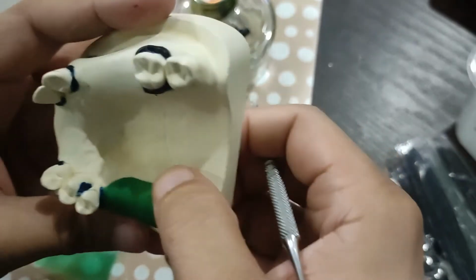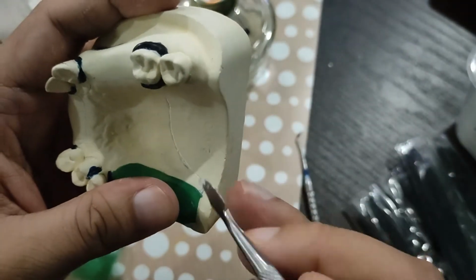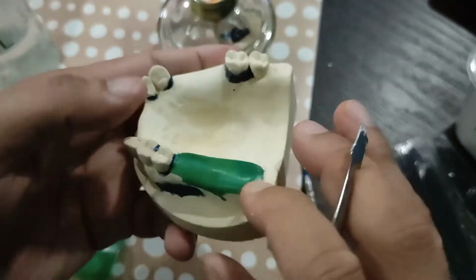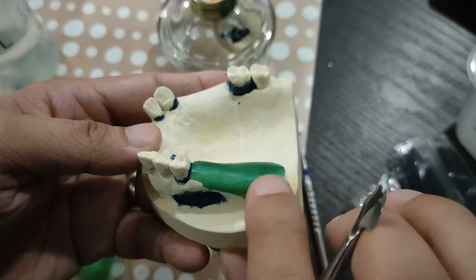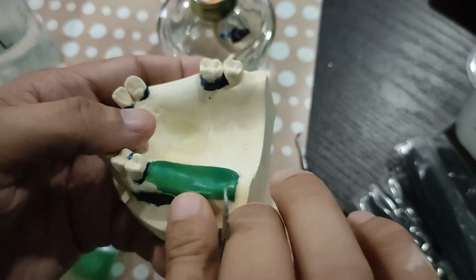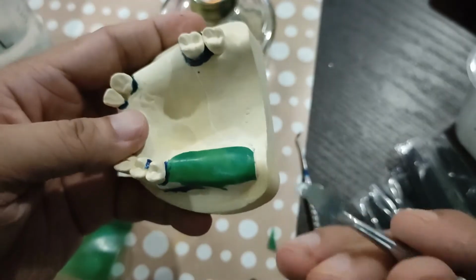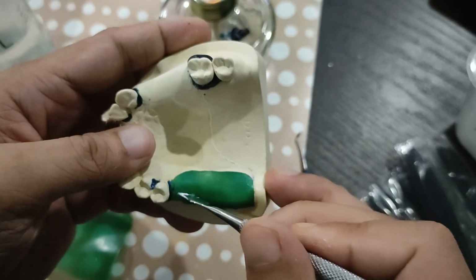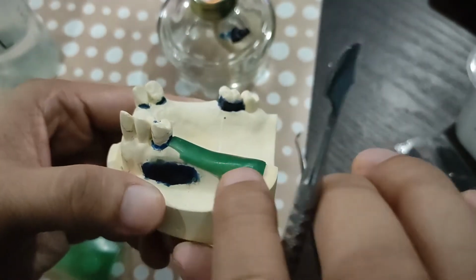So on the palatal side, your borders should be where your denture base would end. On the buccal side, ang borders mo, just go over the crest, no? There's no borders here. What we want you to do is just go over the crest. Okay? Because this is for a metal framework. No? Your metal framework usually ends at around the crest, diba? So, for the relief here, just go over the crest and lute it.